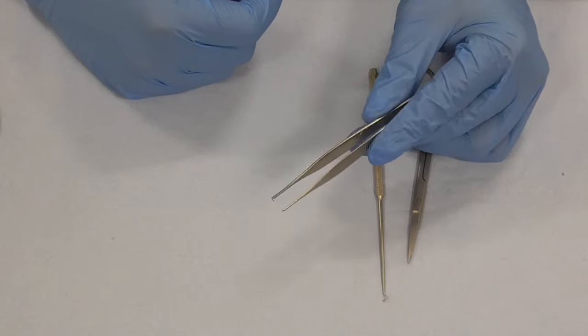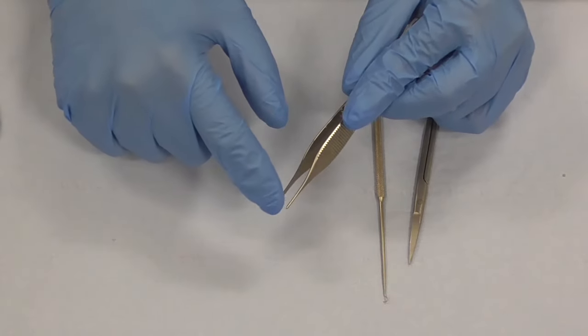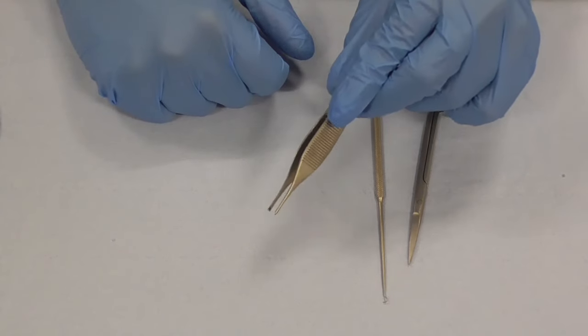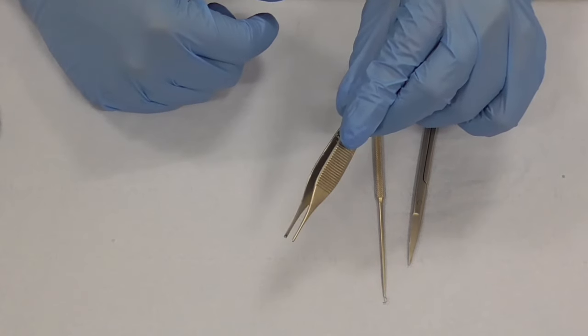What is probably advised for skin suturing is not to actually grasp at all but to use one or the other tooth as a hook mechanism. So you just hold it and we'll demonstrate that when we're showing you how to stitch.